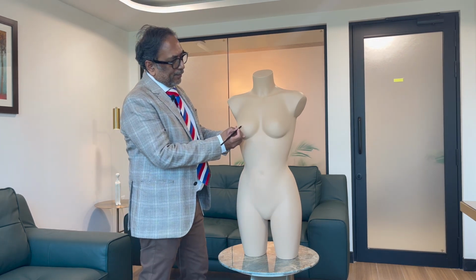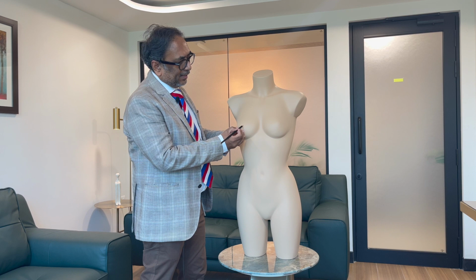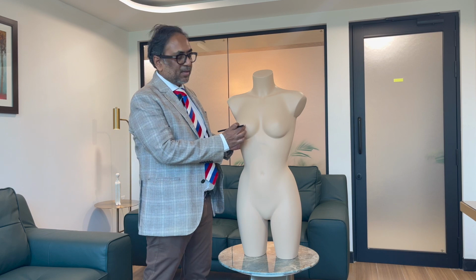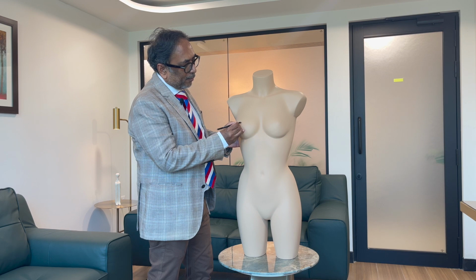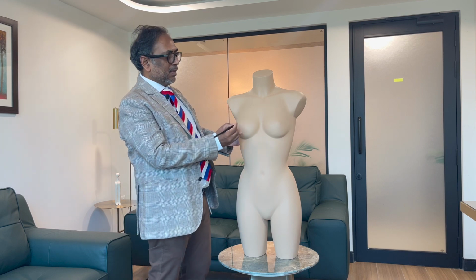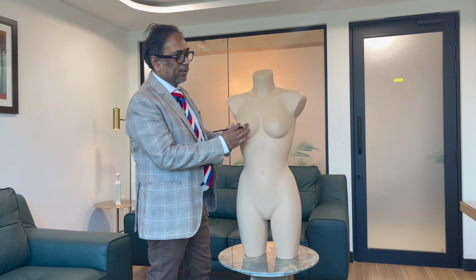Normally, another measurement which we take when a patient is seeking a breast enhancement is the diameter of the areola. In some patients, it might be very, very wide like this, which is more than 4.2 centimeters in diameter. In these patients, we try to reduce the diameter by removing a portion of the skin and suturing it all around the areola, thereby reducing the size of the areola. This is very important because we don't want the areola to be overstretched, especially after we put the implant.